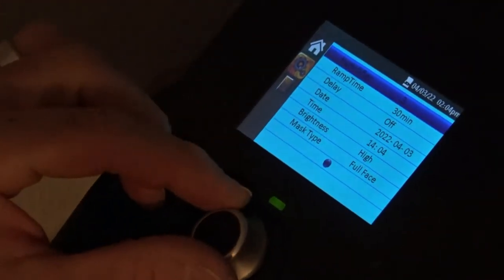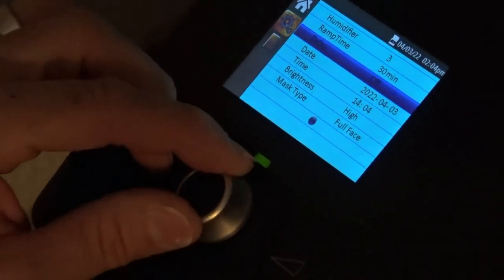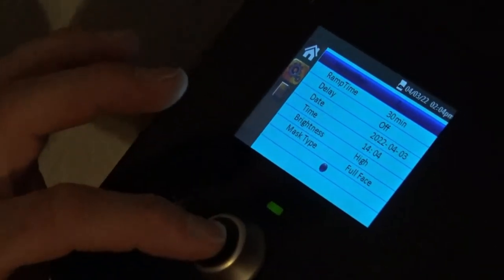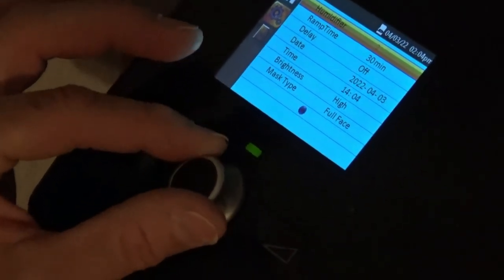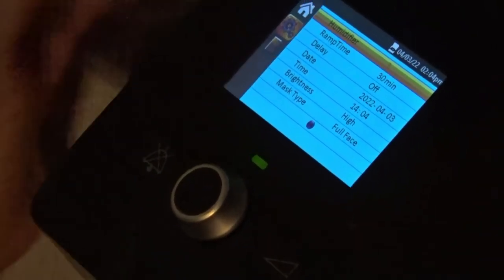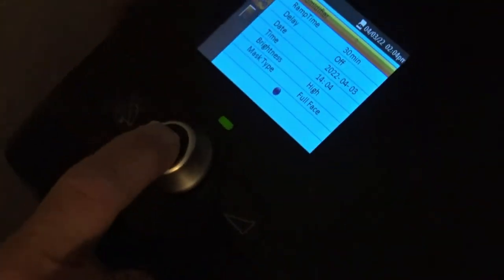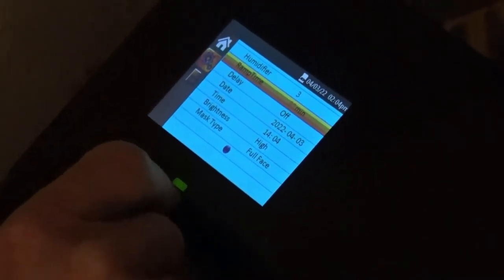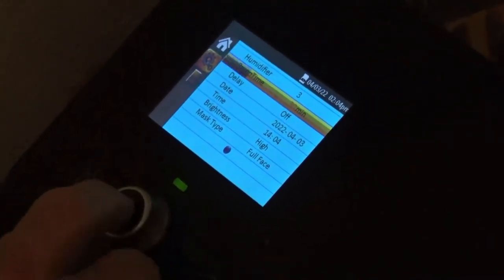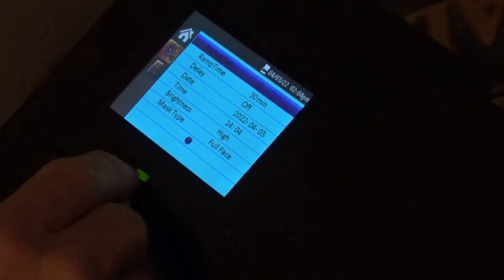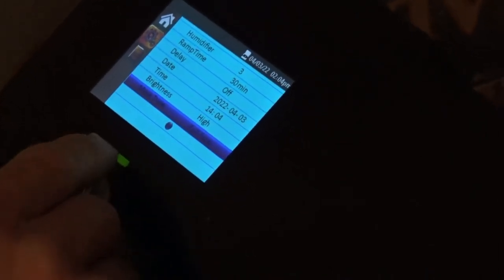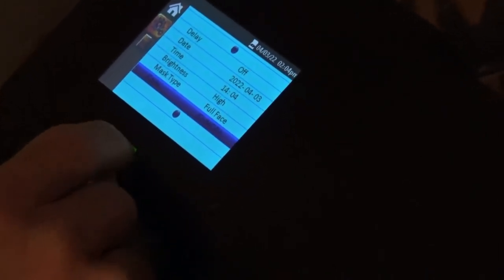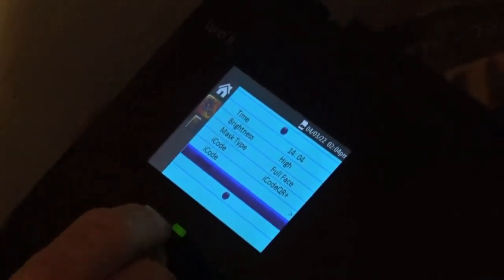Just push down that power button to get over here. If you want to adjust the humidifier, ramp time, or anything, let's say I wanted to adjust the humidifier, I click on it and I can go up and down with the number. But I let my respiratory doctor specialist put all the settings in, so I'm going to leave them all alone. You can click on any of these and go up or down in the numbers.